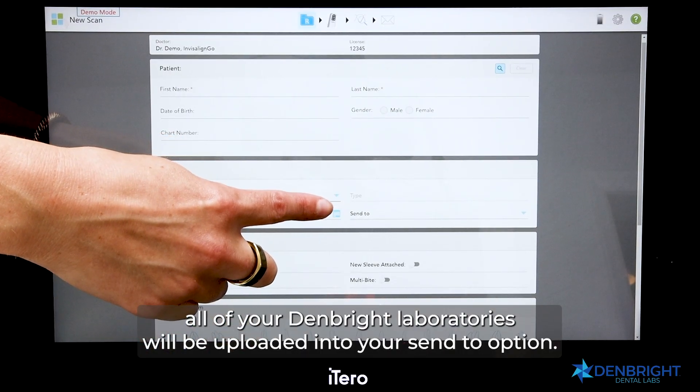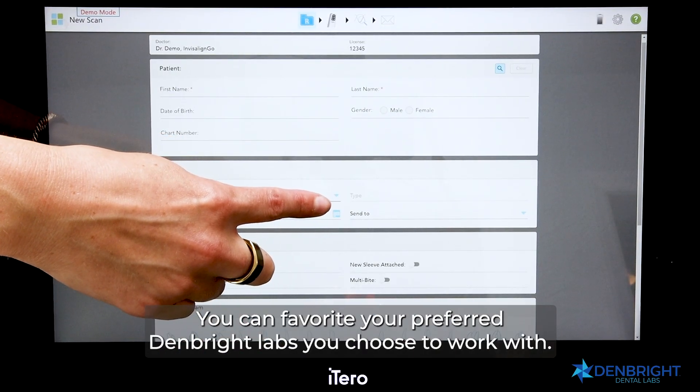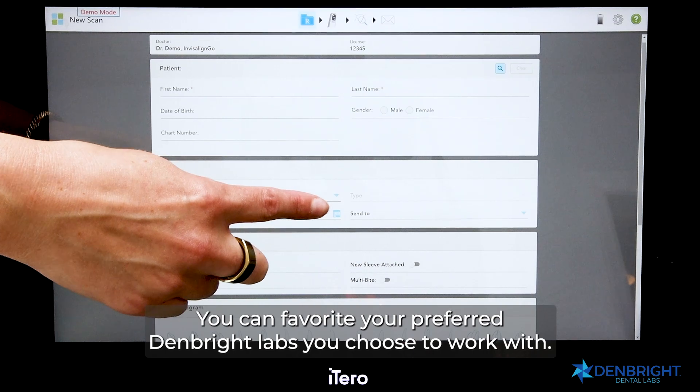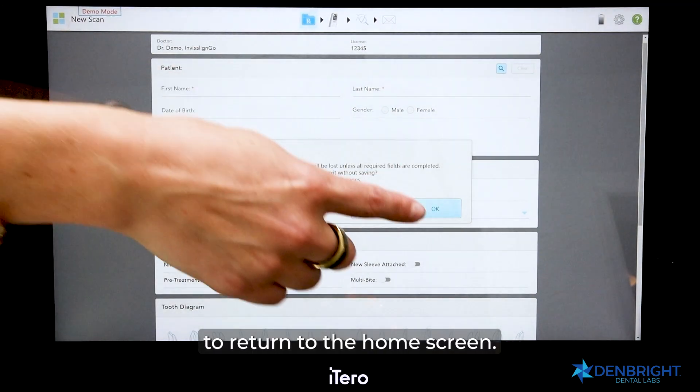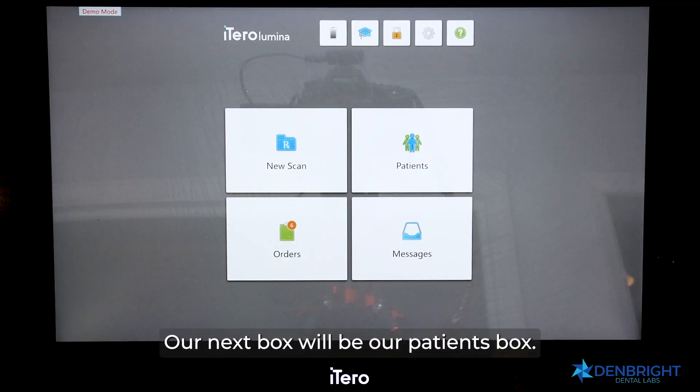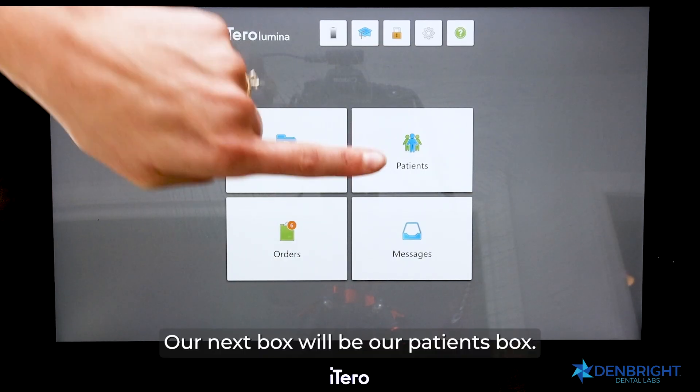All of your Denbright laboratories will be uploaded into your Send To option, and you can favorite your preferred Denbright labs you choose to work with. Please use the upper left-hand box to return to the home screen.